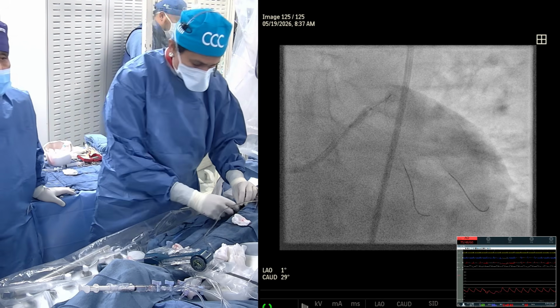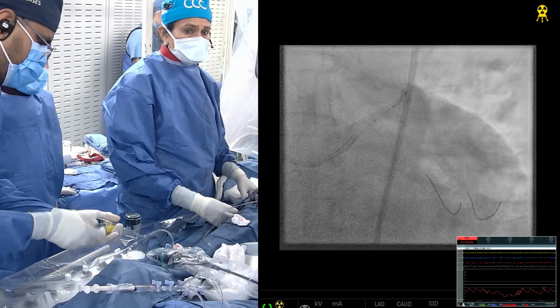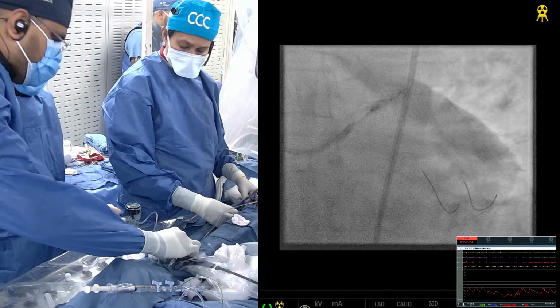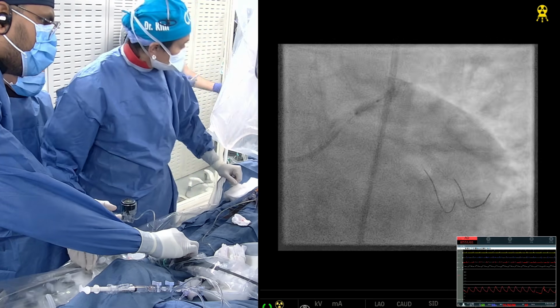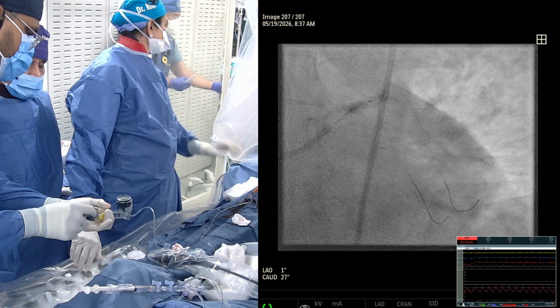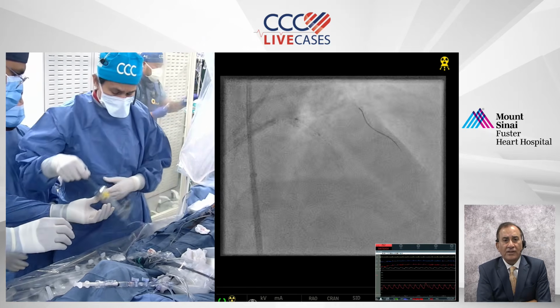The blood pressure does go down because we are inflating in the left main, and that is precisely what all the companies are working on: can you cut down this ischemic inflation time to 5 seconds rather than 10 seconds? Has anybody even thought about creating some kind of perfusion balloon and mounting IVL on that?